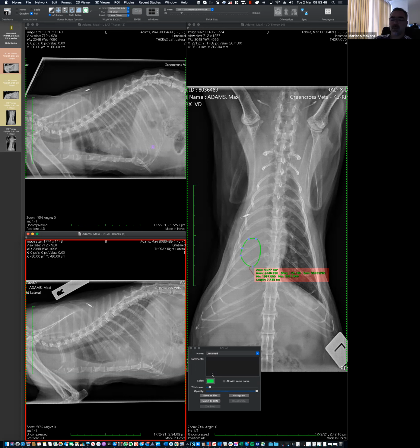So most of the time we are not going to be able to separate. For ultrasound, the physics behind interacting with fluid in the pleural space, fluid-filled lung, or a mass in the lung is going to be different.